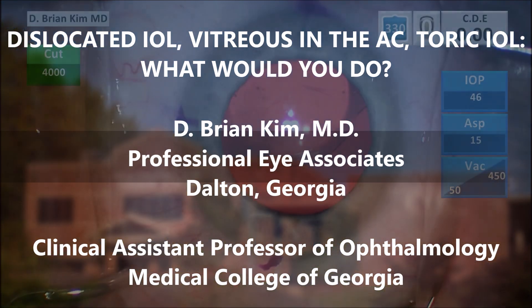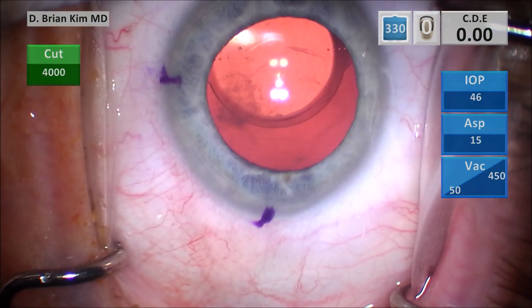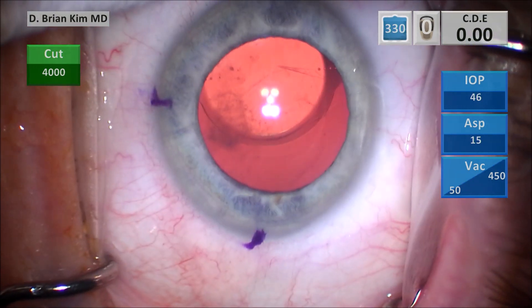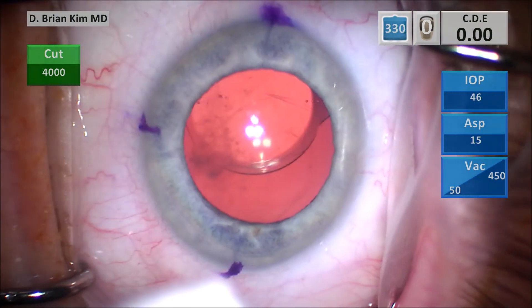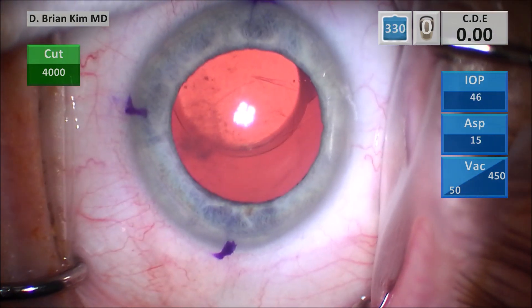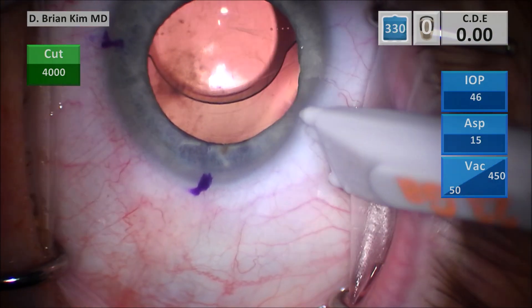This is a Tecnis JNJ ZCT-225 Toric IOL. This patient had a diopter and a half of astigmatism, and you can see that the lens is dislocated nasally. There's a posterior capsule YAG opening, but the lens is dislocated nasally. I'm suspecting that there's a peripheral defect in the posterior capsule, and there's a lot of vitreous in the anterior chamber.